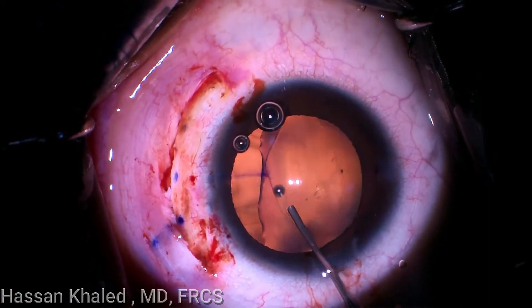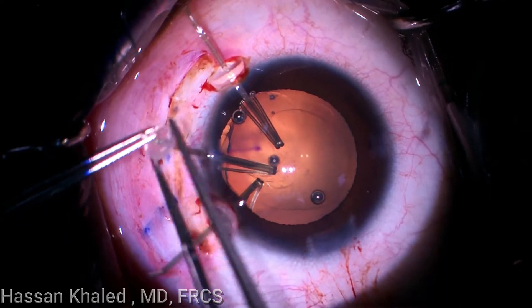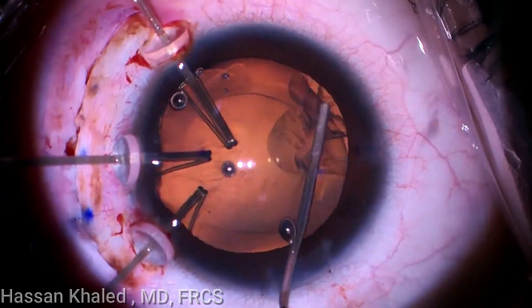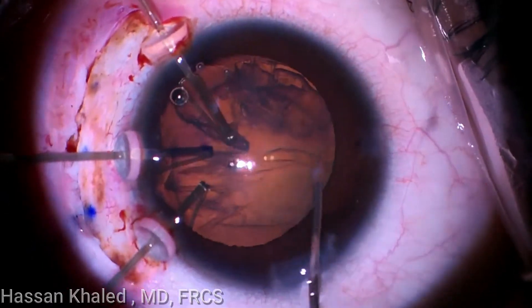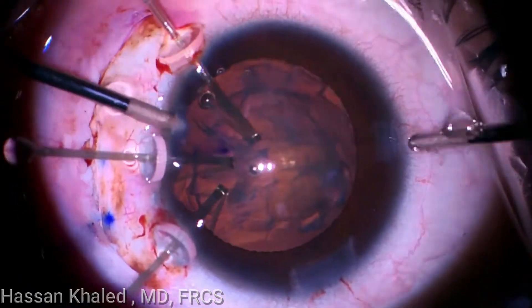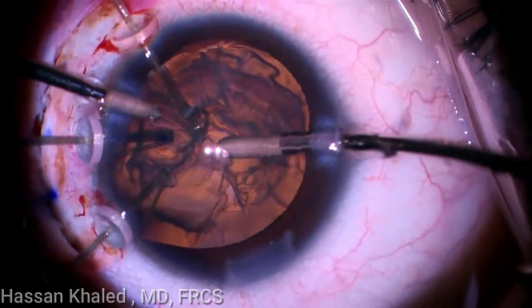Capsular hooks are used to support the capsular bag after creating a space using the OVD. Irrigation and aspiration was then used to aspirate the soft lens, as you can see.